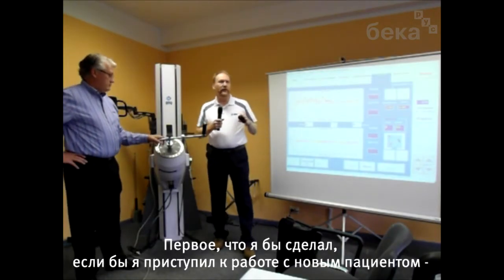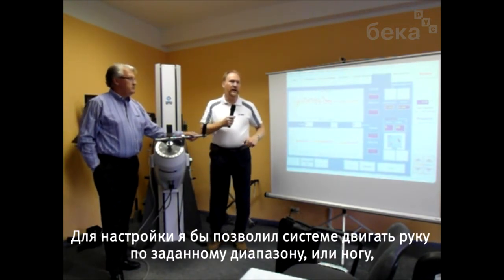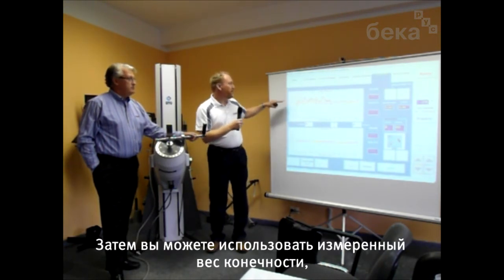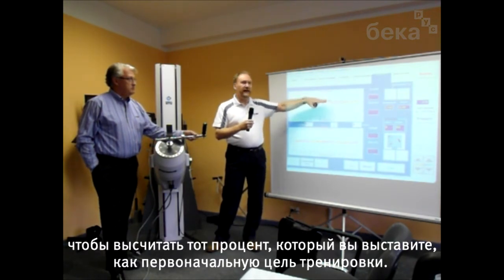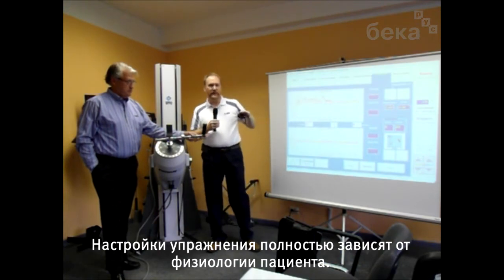So what I would do for a new patient, if this is the first time you've done it, is the way I did it initially with Mr. Weatherington: I would have it set up and let the machine move their arm through the range, or their leg, whichever limb you're using, and then you can take a measurement of how much the limb weighs, and then calculate a percentage of that to set as the initial target for training. So you're going to, again, be setting it at a level that's based on that person's physiology.